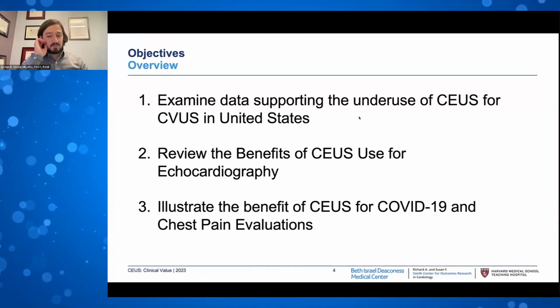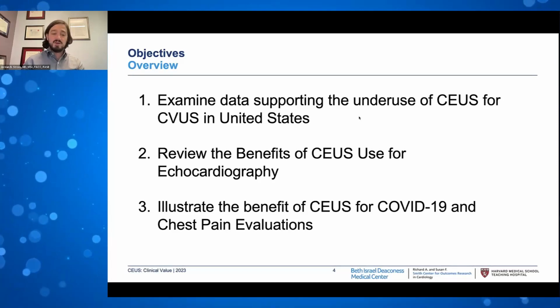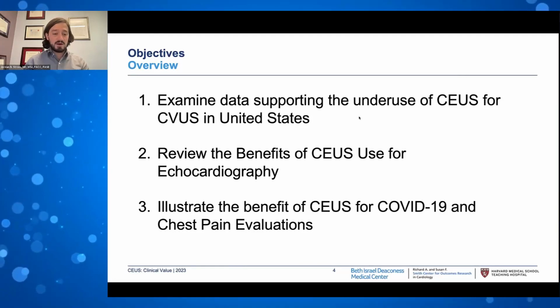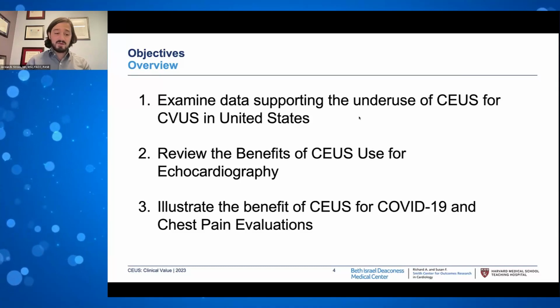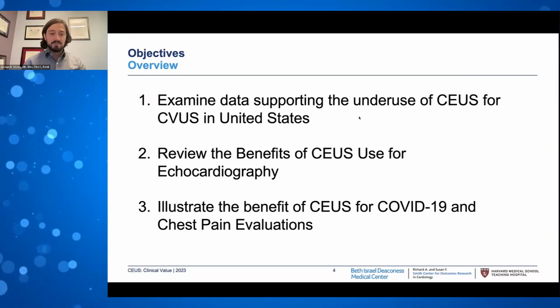We'll examine data supporting the underuse of contrast-enhanced ultrasound for cardiovascular ultrasound in the US. We'll review the benefits of contrast-enhanced ultrasound for echocardiography. And in addition, we'll illustrate the benefits of contrast-enhanced ultrasound for COVID-19 and chest pain evaluations very specifically.